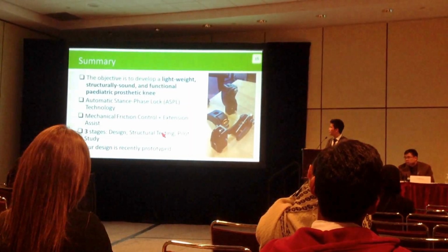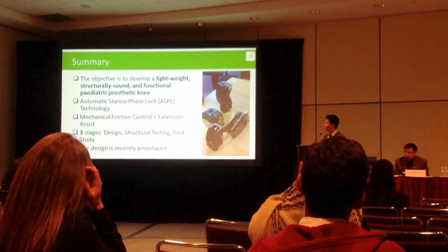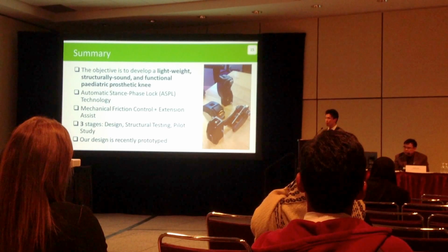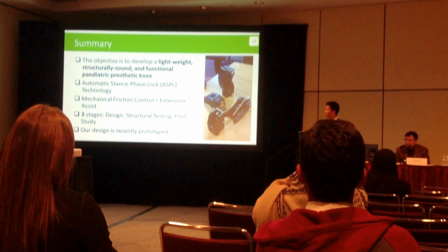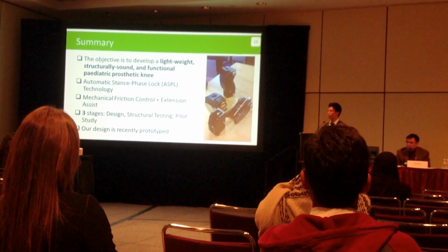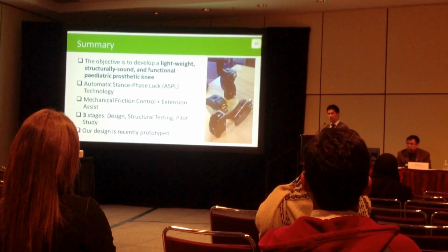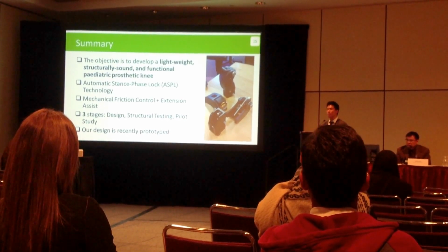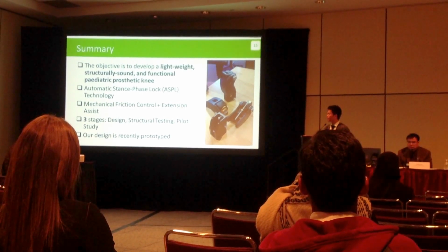So in summary, the objective of this project is to develop and evaluate a pediatric knee that is lightweight, structurally sound, compact, and yet highly functional. It uses the ASPL technology for stance-phase control, and also incorporates the mechanical friction control and extension assist for swing-phase control. There are three stages in this project: designing, structural testing, and pilot study. Now we've just finished the prototype and are ready for testing.